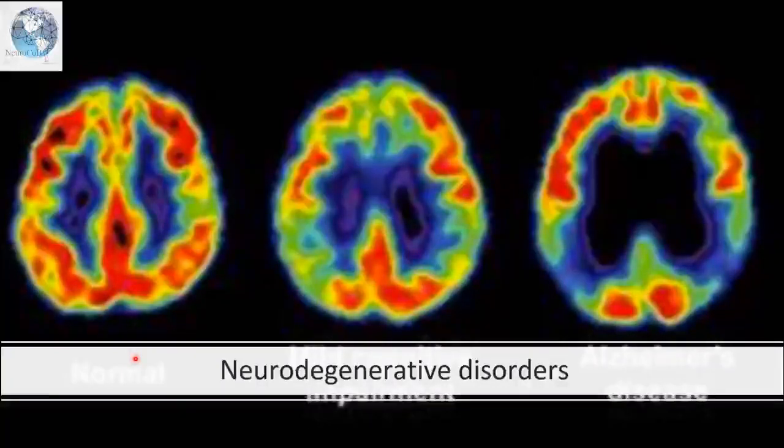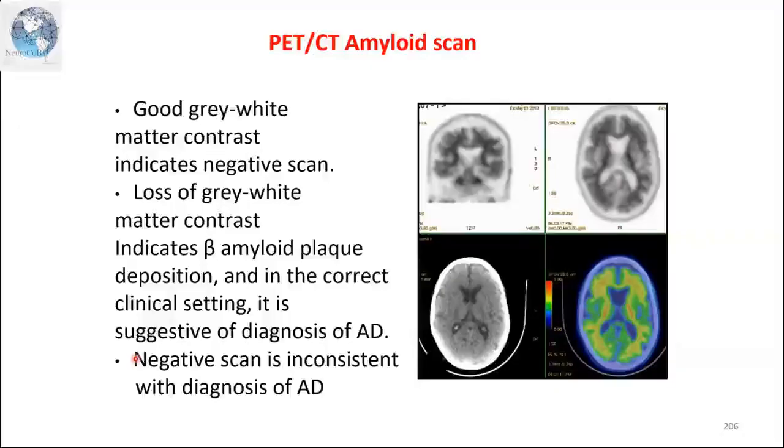But the color coding you have to be careful, tengoklah dia punya sidebar tu. Sometimes warna merah tu mengatakan hypo, walaupun kita rasa merah tu hyper kan sekarang kan. But it depends. Kita tengok color coding tu kat bar tu untuk tahu ada detecting like higher standard deviation from the low part or the higher part. Then you will know, oh, I'm detecting hypometabolism actually. Okay, so you look at the color coding in the bar.